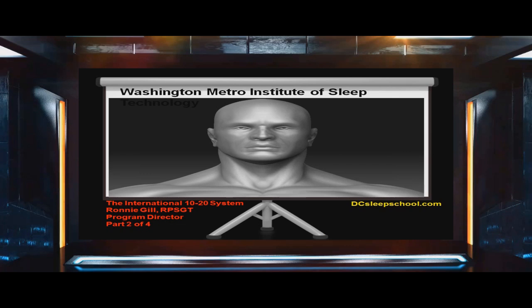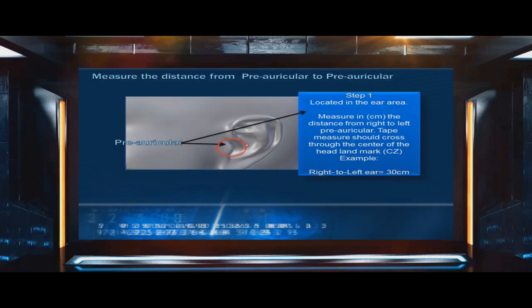Washington Metro Institute of Sleep Technology — the International 10-20 System Overview, Part 2. Measure the distance from preauricular to preauricular. The preauricular point is located in the ear area, as shown. This is where you will start your measuring tape. Measure in centimeters the distance from right to left preauricular. Your tape measure should cross through the center of the head at landmark CZ. Example: right to left preauricular equals 30 centimeters.